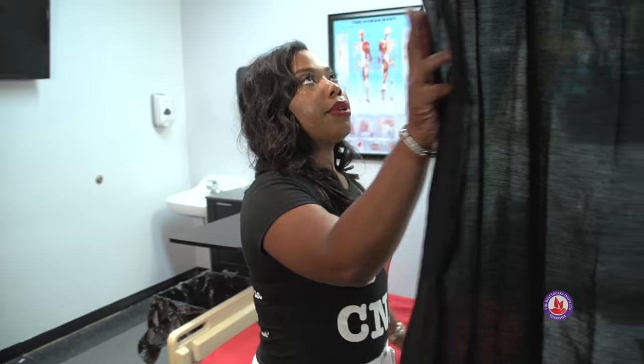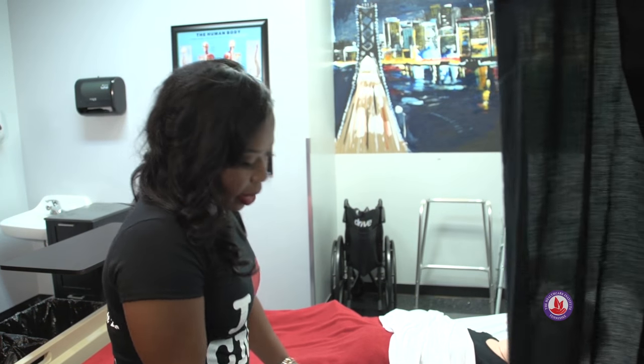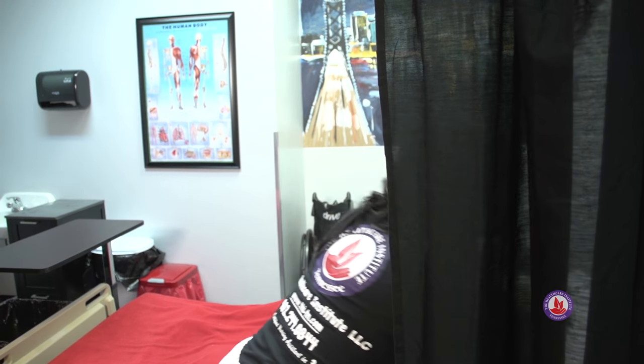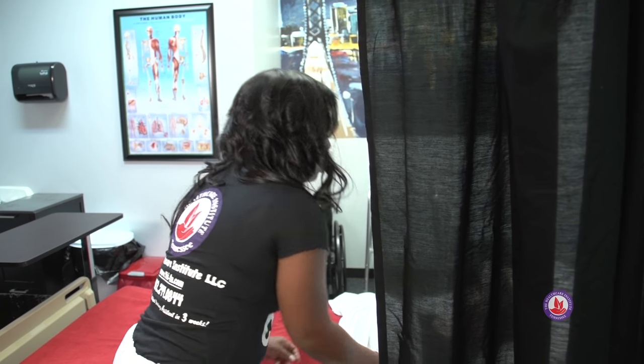Now that I'm done, I'm going to push my privacy curtain back, let her rail down, and provide her her call light. Ms. Dolly, if you need anything, I'll be right down the hall. I'm washing my hands and I'm done.